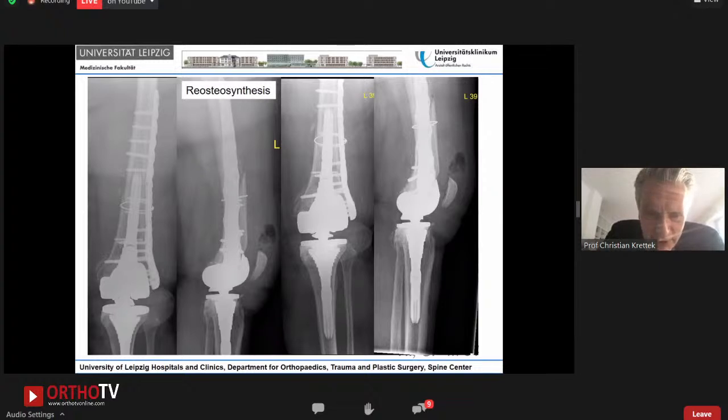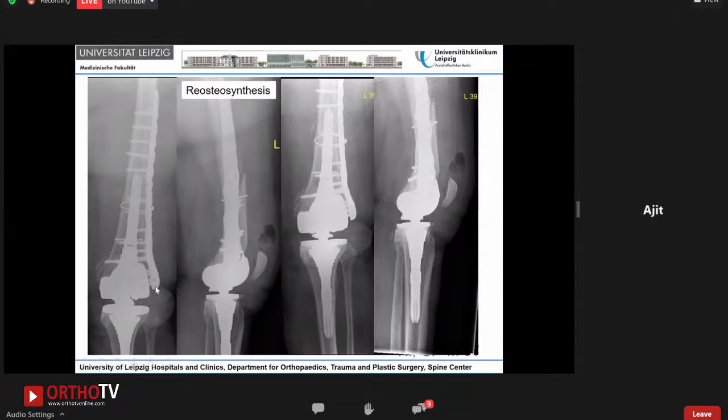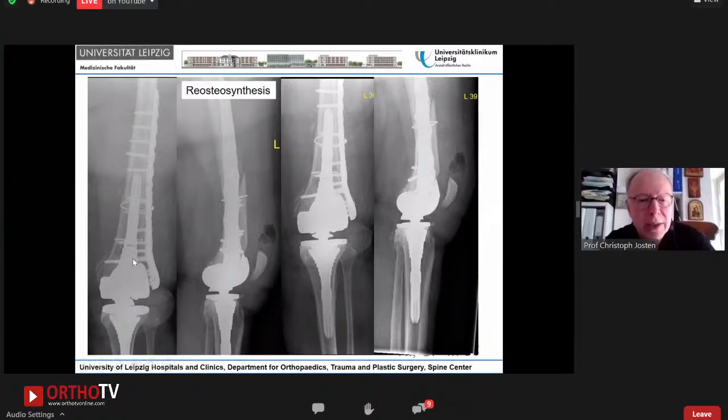And at the revision, you turned around one cerclage at the proximal level. But still, the distal level is somehow unclear to me how it is secured. Question is, are the locking screws distally inside the cement or are they short screws? This would be a concern for me. Yeah, excellent analysis, Christian. It's very difficult to place the screws between the shield of the prosthesis and the stem of the prosthesis. So these are short screws, and only these are screws passing beside or bicortical screws. And this analysis from your side is absolutely correct.